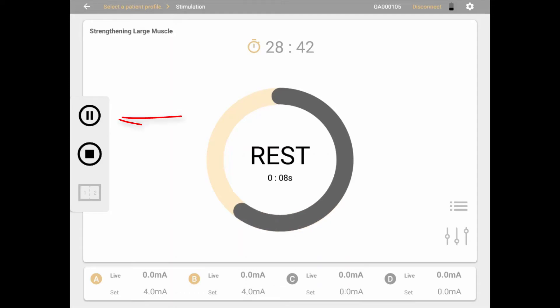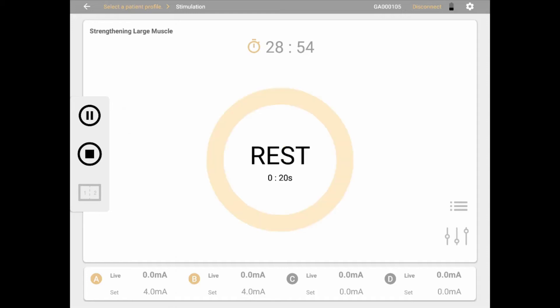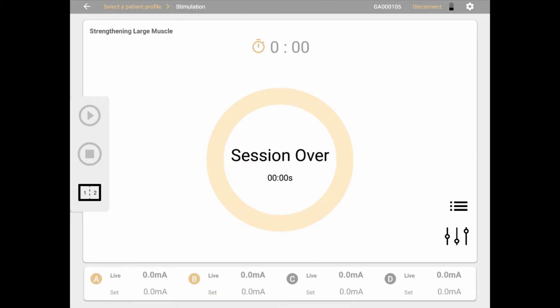Clicking the pause icon on the left of the screen will pause the session, allowing you to resume when desired. You may also pause the session from the Mionics device by clicking the Back button. To stop the session, click the Stop button on the left of the screen. You may also stop the session on the Mionics device by clicking Back twice or clicking the Power button.